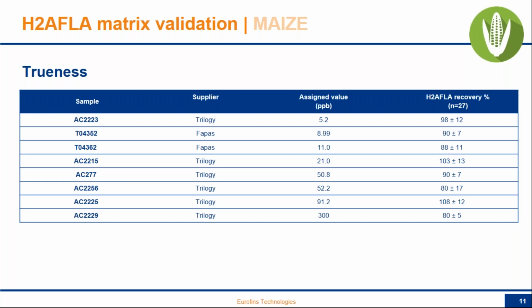And similar results were obtained, just to remind a little bit, with the B0, the assay calibrated with a virtual curve, and this was due to the good robustness of the system. So the removal of the calibration did not affect the overall accuracy of the kit.